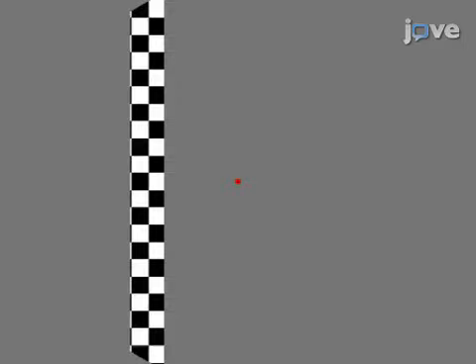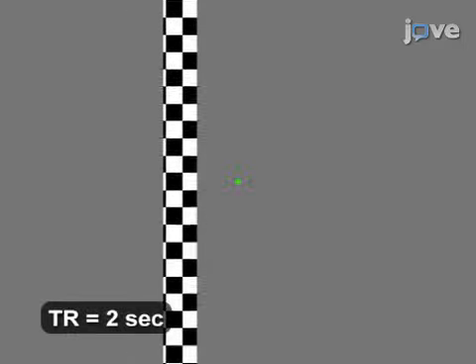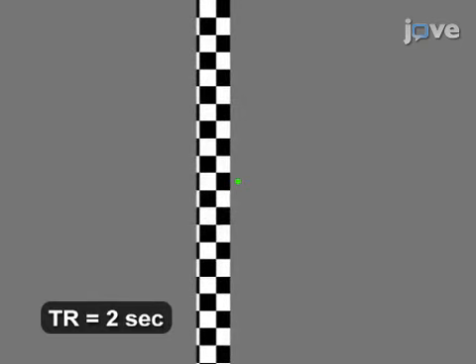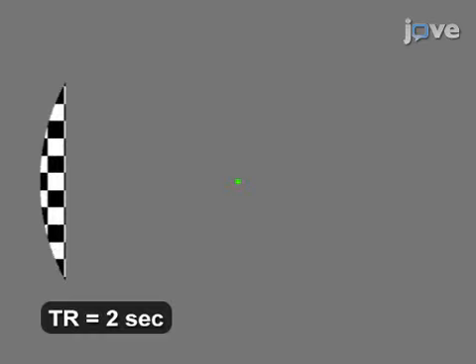To prepare a stimulus protocol that is effective in eliciting a reliable retinotopic visual response, first, present bar stimulus drifting across the screen sequentially along 8 directions in 45-degree steps. Ensure that the motion is in synchrony with the scanner frame acquisition, so that the bar moves a step once an fMRI frame starts and stays at the new location until the frame ends.